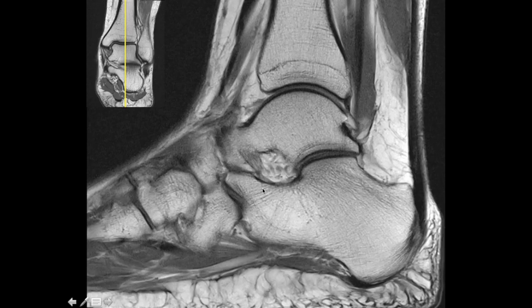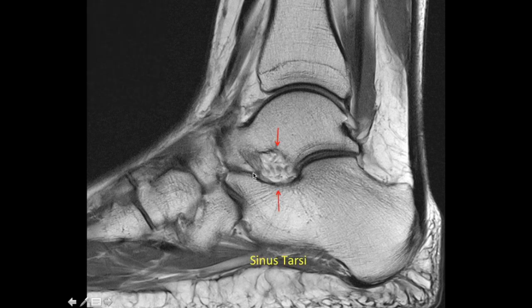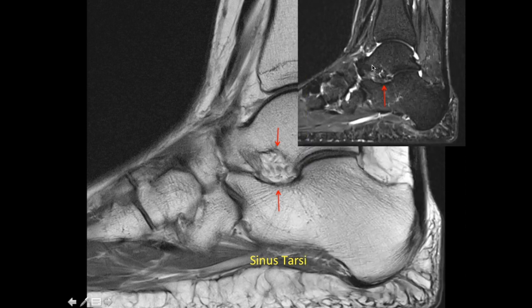The third structure seen on the sagittal image is between the talus and the calcaneum — the sinus tarsae. Sinus tarsae is hyperintense on proton density images because it predominantly consists of fat along with small ligaments like the cervical ligament and neurovascular bundles. Because it contains mainly fat, it appears hypointense on fat-saturated images. Any edema or fluid within the sinus tarsae would indicate sinus tarsae degeneration, which can occur in multiple conditions.